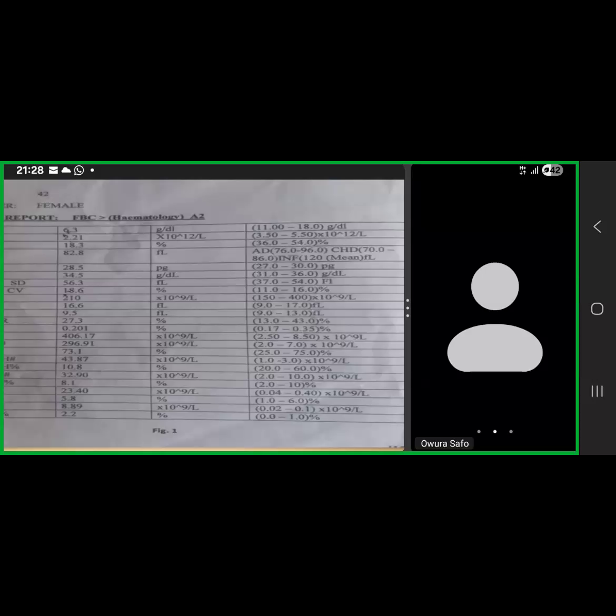Why have you decided they don't matter? It does. Basophilia, eosinophilia, yes, and then monocytes to an increase in size. So why are you not minding them, as if they are not there? You are right, sir.